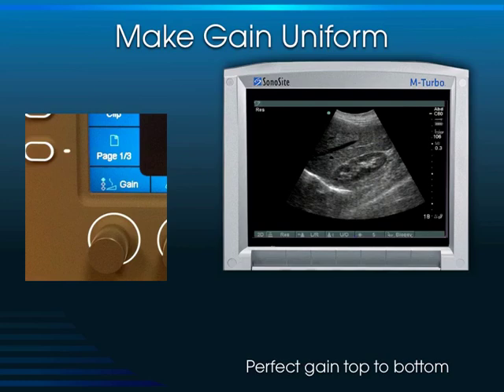So if I had to rank everything on the screen in terms of their levels of echogenicity, and that's a fun question of mine to ask, rank the following in terms of their echogenicity. Number 1 would be the diaphragm. Number 2 would be the renal sinus. Number 3 would be the liver. Number 4 would be the renal cortex. And then number 5, the least echogenic structure, would be the hepatic vein. Make sense? I'm just trying to get you to think about some of the art of this. We're going to move on now.